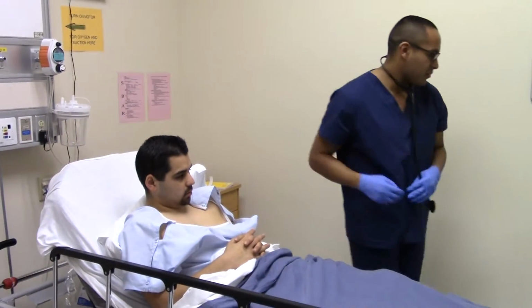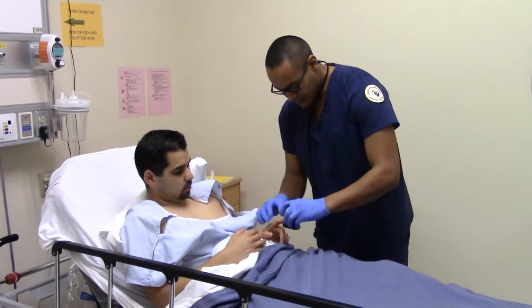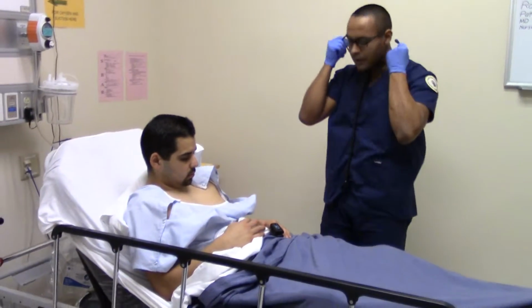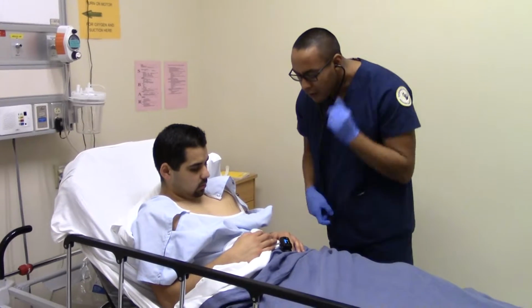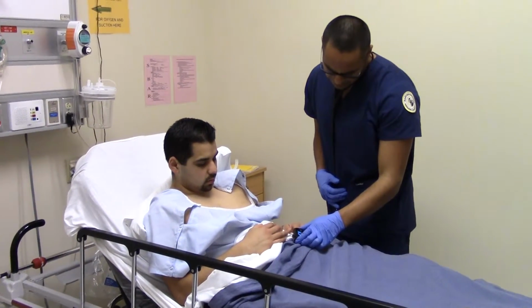You know what? I'm going to go ahead and put the pulse ox on. Just rest it there. Okay, hold on.